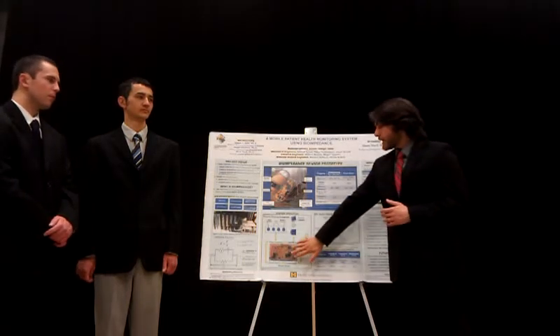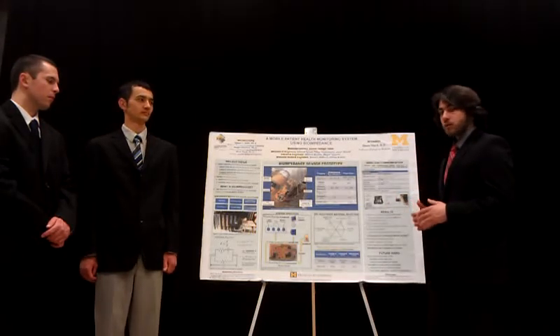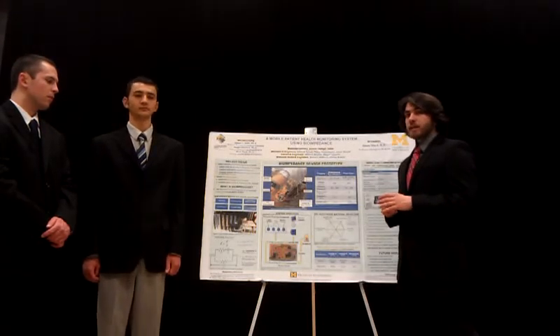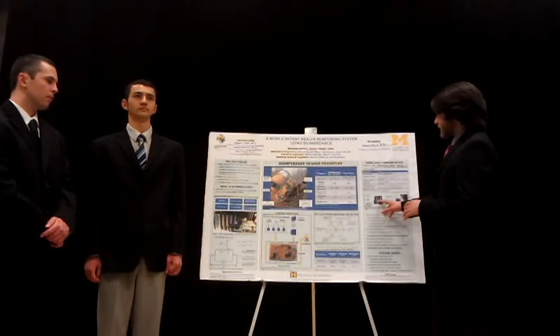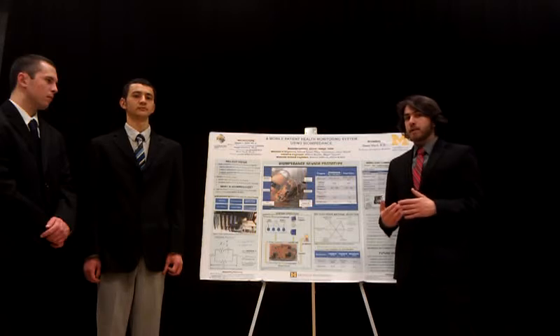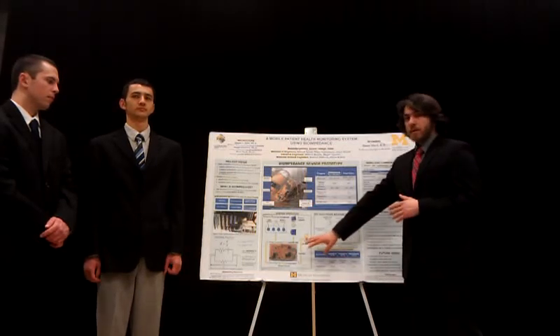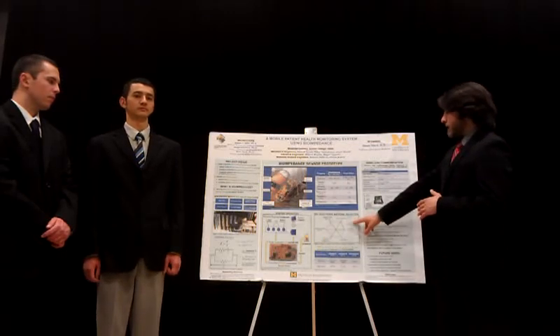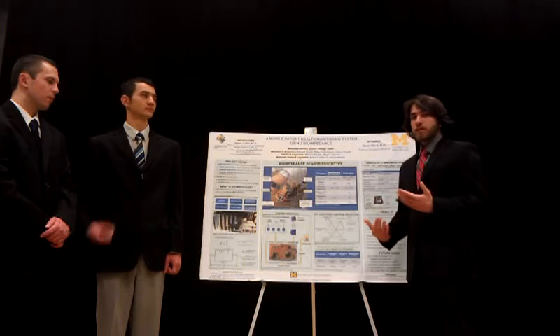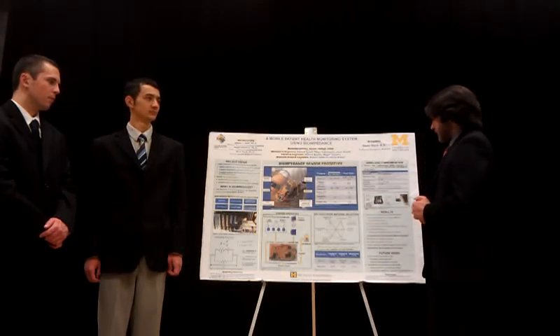The first thing is making this circuit a printed circuit board. That will definitely make it a lot smaller, with the Arduino and the Zigbee radio on it as a chip to do the same functions. And also for the electrode material, we can use platinum or gold if we have a better budget.